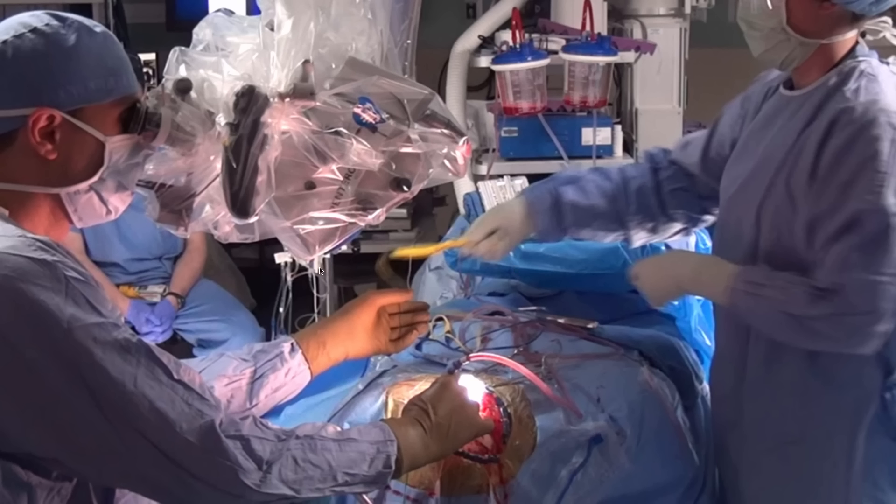This cross-table positioning allows easy transfer of the instruments. In addition, the surgeon is sitting to facilitate working during the microsurgical part of the operation, with his arms resting on the armrest.